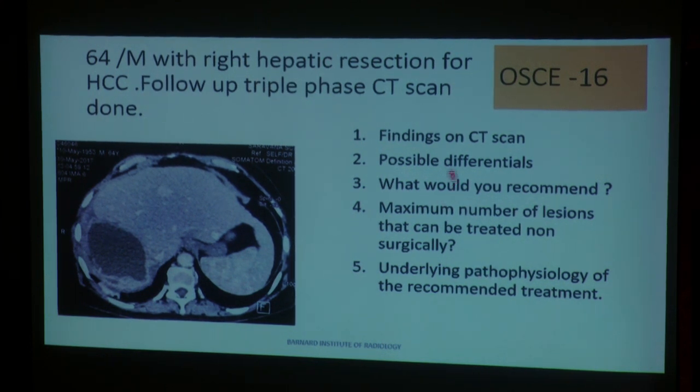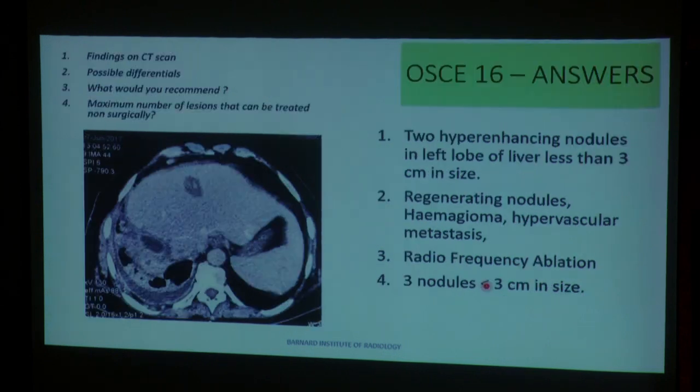So what are the findings on the CT scan, the differentials, how would you manage, and depending on the number of lesions, how would you manage, and what is the pathophysiology.